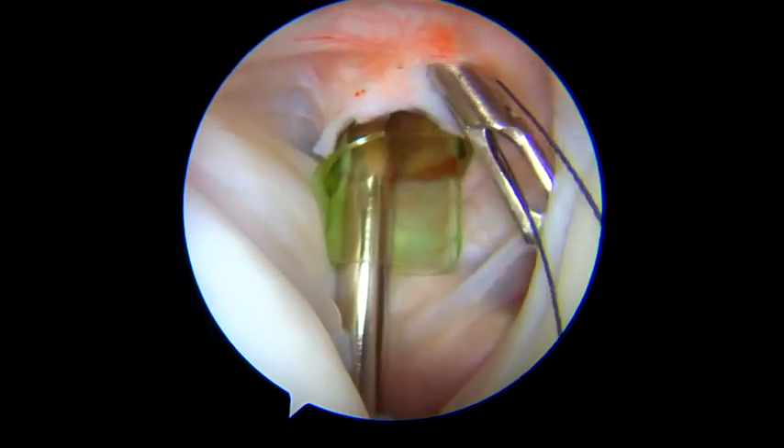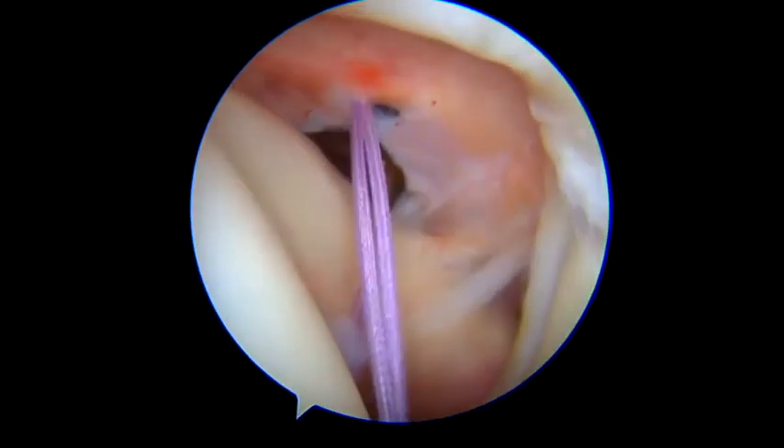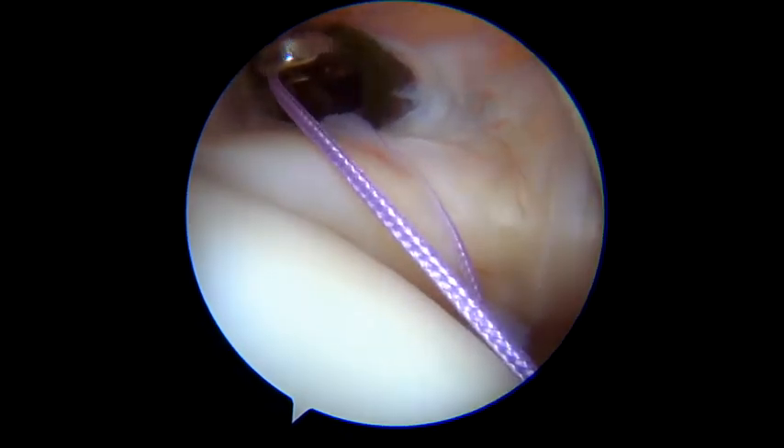This accessory portal is recommended to be placed right next to the anterior instrumental portal. Using the passing suture technique, a non-absorbable high-strength suture thread can then be passed through the inferior capsular tissue.